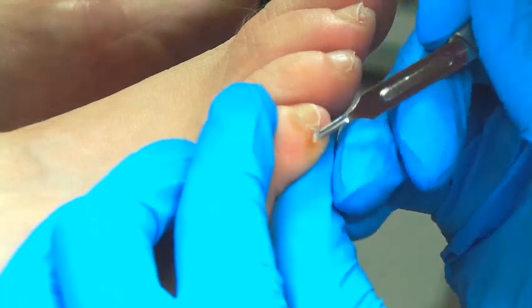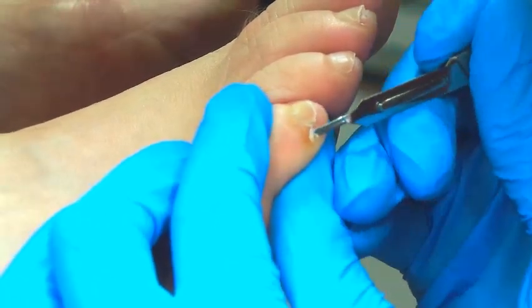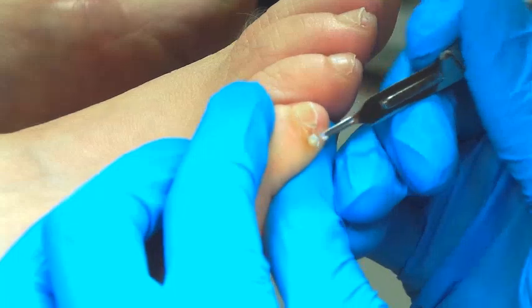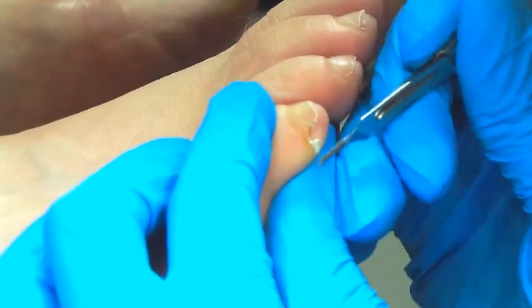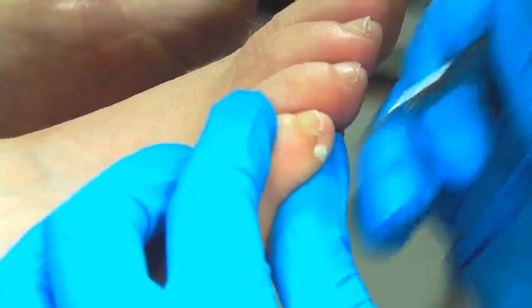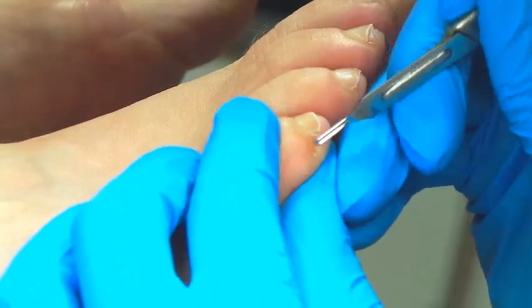Hi guys, here's another video that I've taken with one of my lovely patients. You can see that on the side of her toe she's got what's known as a heloma molle — it's one of those really annoying things that you get in between the toes. Usually the patient's toe is slightly subluxed and there's a lot of pressure. You can see the blade I'm using is a Swann-Morton — and there it comes out.